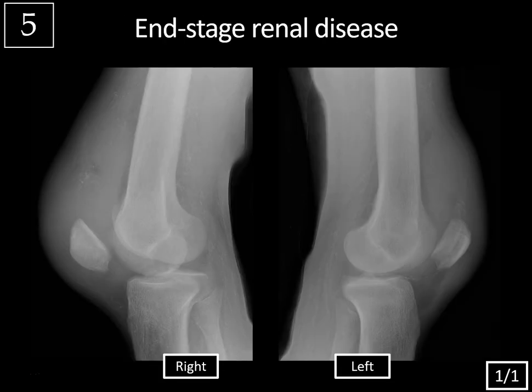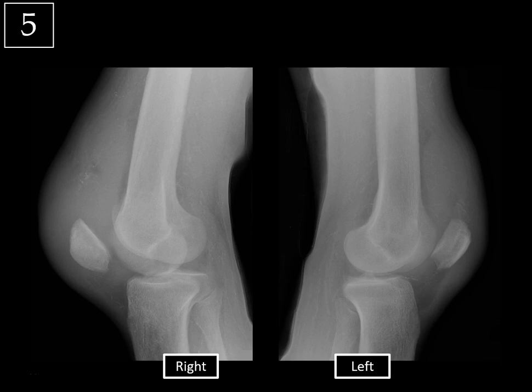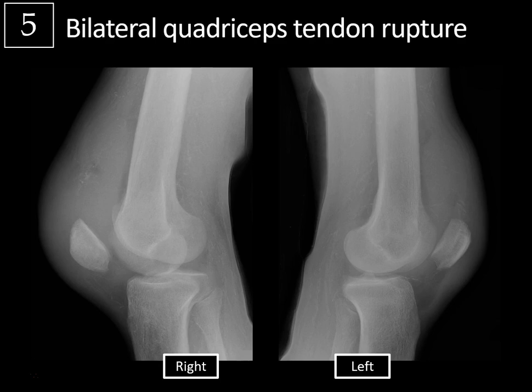Last case — history of end-stage renal disease. We're looking at lateral views of both knees. There is severe prepatellar and suprapatellar soft tissue swelling bilaterally, as well as large suprapatellar joint effusions, more pronounced on the right. The patellae are low-lying bilaterally — abnormally low — known as patella baja (the opposite, a high-riding patella, is patella alta). There is also vague calcification in the expected region of the quadriceps tendon bilaterally. This patient had bilateral quadriceps tendon rupture in the setting of end-stage renal disease.